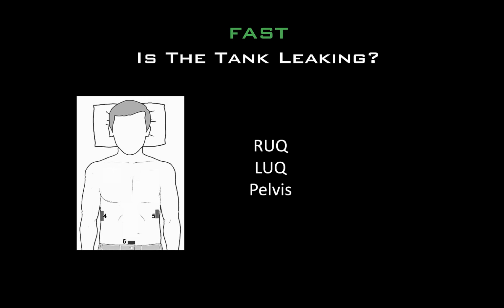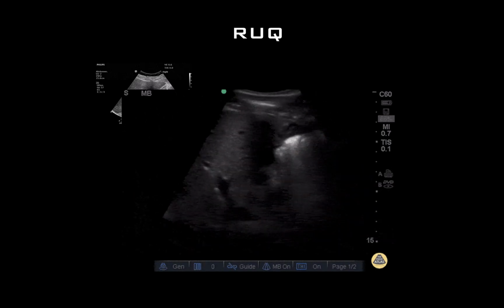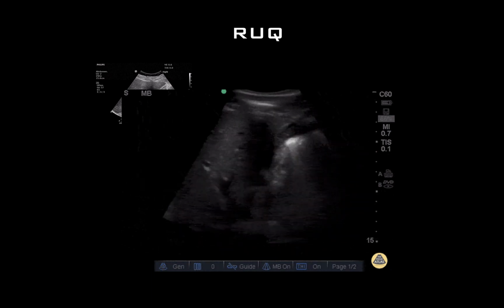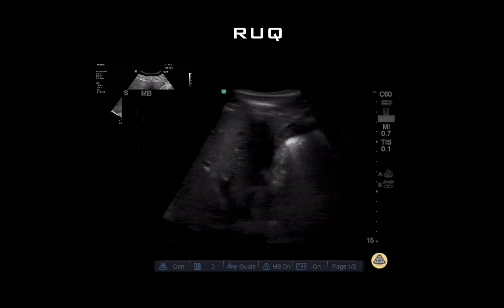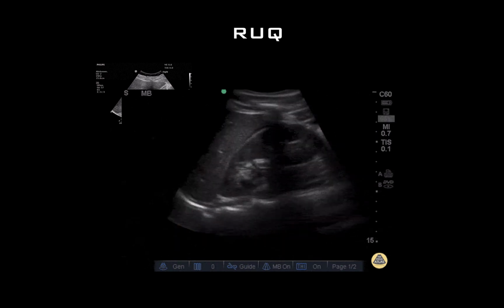It is critical to appreciate that free fluid in the abdomen is nonspecific, and this can range from physiologic free fluid, ascites, to infections and gross hemorrhage. Here is a case of a medical patient with spontaneous cause of intraperitoneal hemorrhage post-thrombolysis for STEMI. While this is more common in trauma patients, it can occur in medical patients as well, particularly iatrogenically after percutaneous or endoscopic procedures. Again, I caution you that these findings are nonspecific.